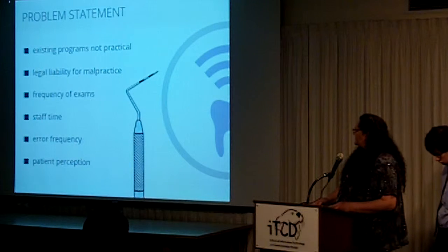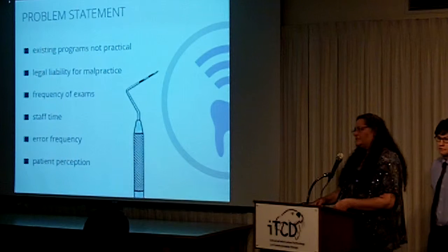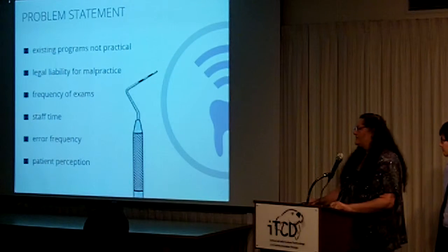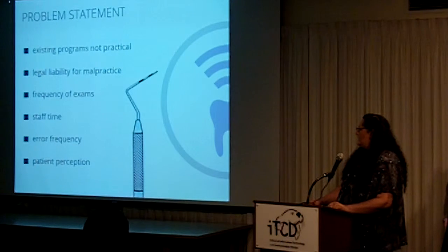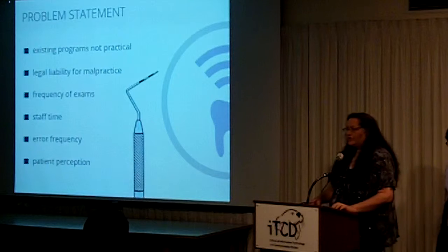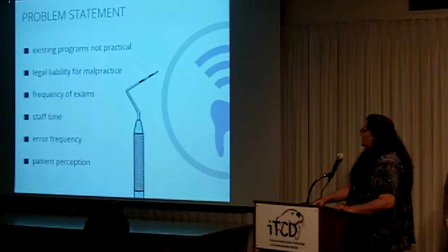The problem that hygienists have is it's really difficult to do periodontal charting by yourself. You need a dental assistant to write it down for you. There have been programs in the past, but they haven't worked very well because voice charting software hasn't been very good. It's changed now, and there's a lot of good stuff out there.